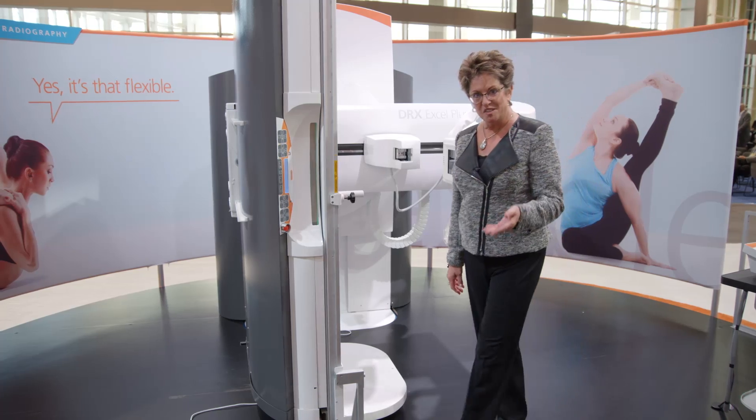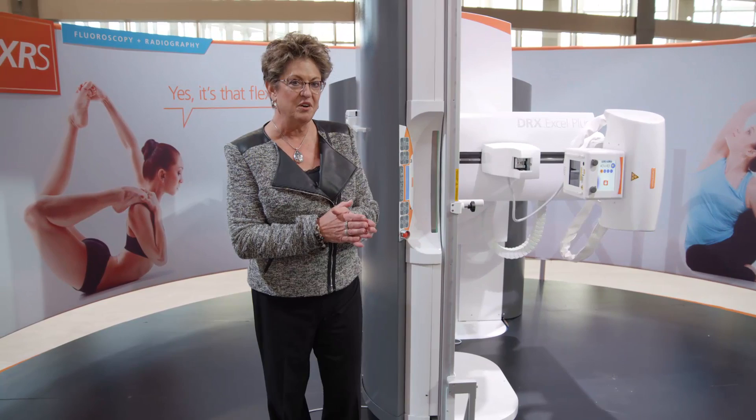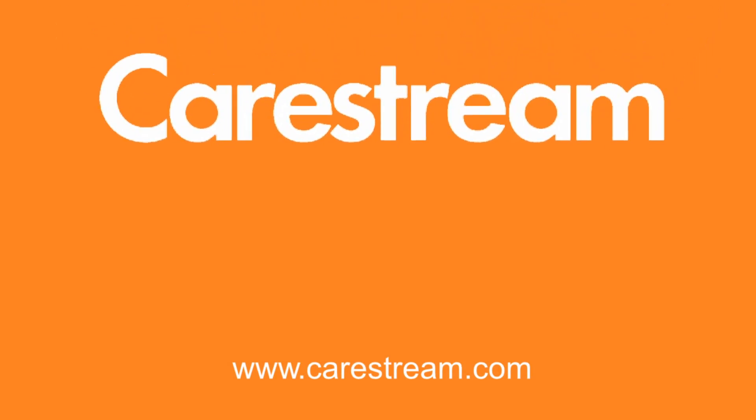So thanks so much for taking a look at the DRX-Excel Plus — total flexibility for radiography and fluoroscopy in a single system.